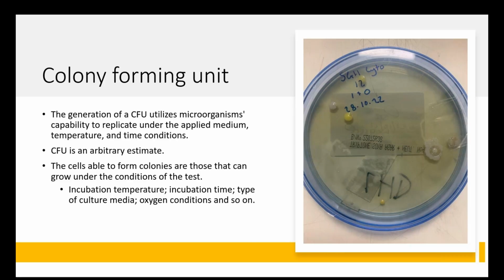But the CFU is always going to be an arbitrary estimate because, first of all, only those cells that are able to form colonies under the particular conditions of the test will produce a visible colony, and this is going to be dependent upon incubation temperature, incubation time, the type of culture media, the oxygen conditions, and so on.